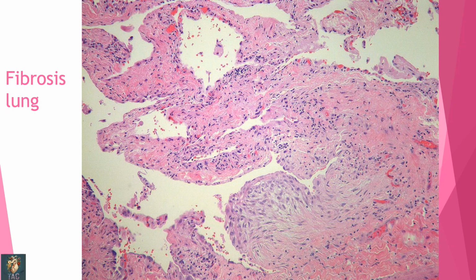In these slides, you can see lung tissue, and different fibrotic areas are present throughout the slide. You can appreciate over here fibrous tissue. So the diagnosis is lung fibrosis or pulmonary fibrosis, and it cannot be ignored as all the picture is very clear.